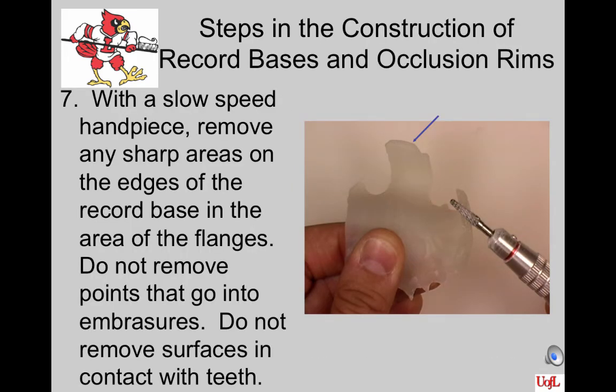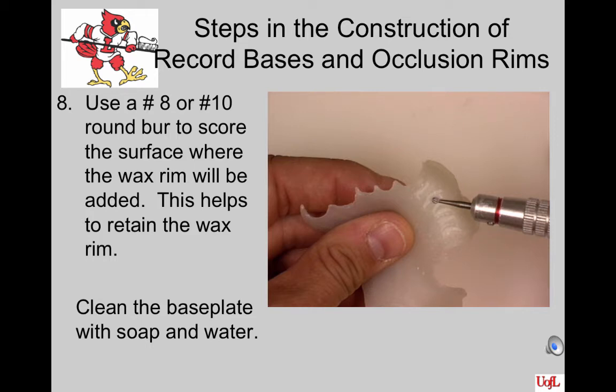With a slow speed handpiece and an acrylic resin burr, remove any sharp areas on the edges of the record base in the area of the flanges — those edges should be rounded and have no right angles. Do not remove points that go into the embrasure; you may round them slightly, but you want that area to extend into the embrasures for lateral and anterior-posterior stability. Do not remove surfaces in contact with the teeth unless you have taken the material too close to the occlusal surface and possibly have an occlusion interference. If you didn't place retention into the base plate prior to curing, use an 8 or 10 round burr to score the surface where the wax rim will be added. Place retention on the buccal flange and slightly on the lingual so that the combination locks the wax mechanically onto the base plate. Be sure to clean it again with soap and water.